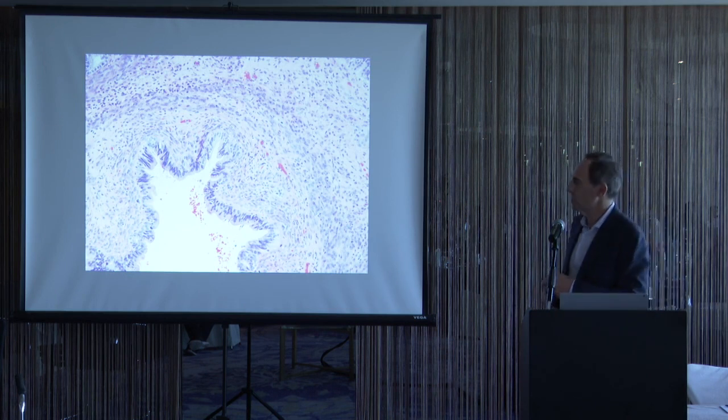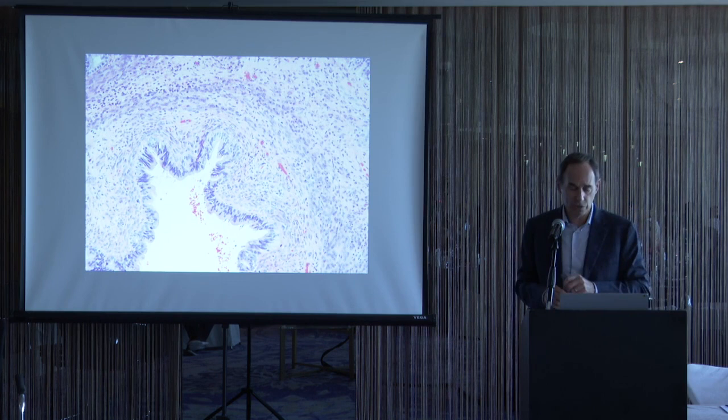In contrast, this is teratoma. What one typically sees with teratoma in germ cell tumors is that it will not have the subnuclear vacuoles, it will not have the dense pink secretions, and typically it will have a muscle collarette around those glands.